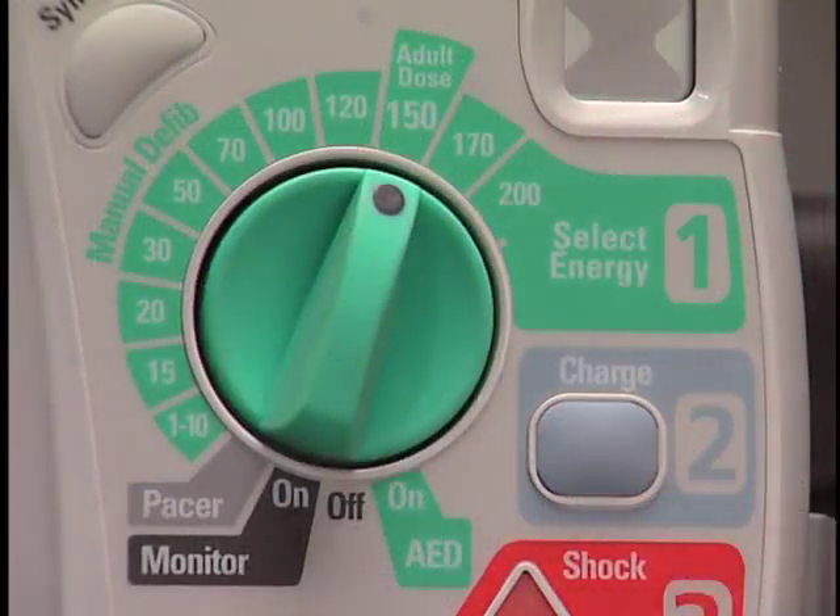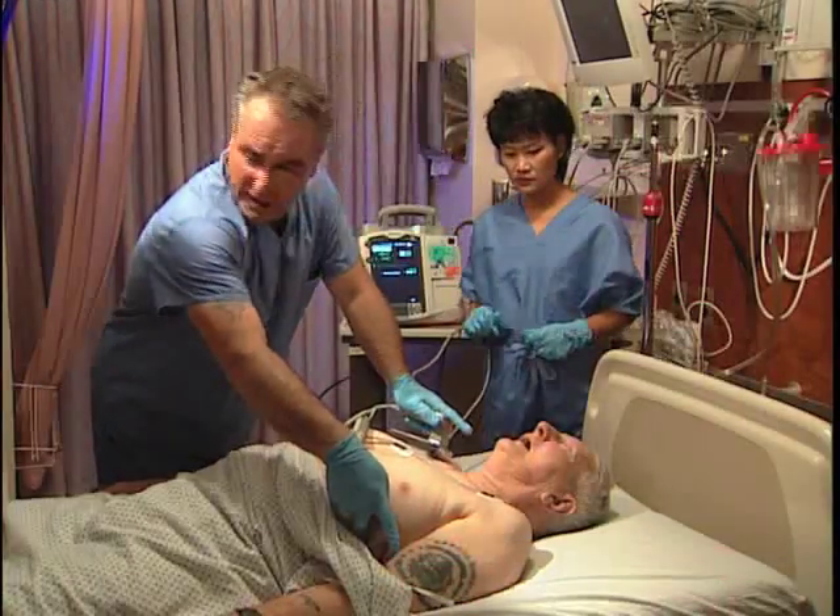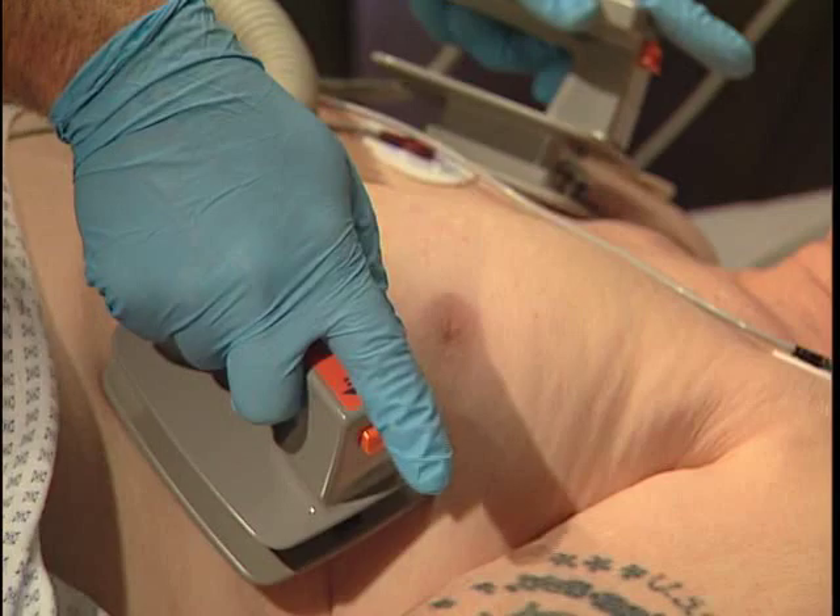Then press CHARGE. Make sure no one is touching the patient or anything connected to the patient. Press SHOCK.